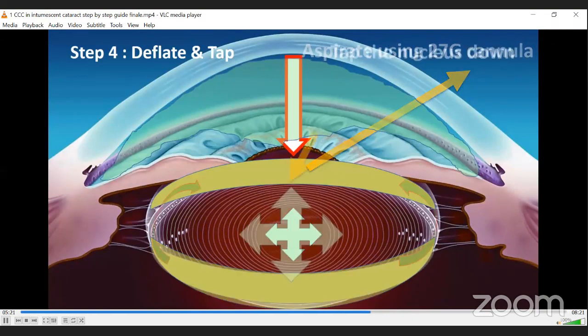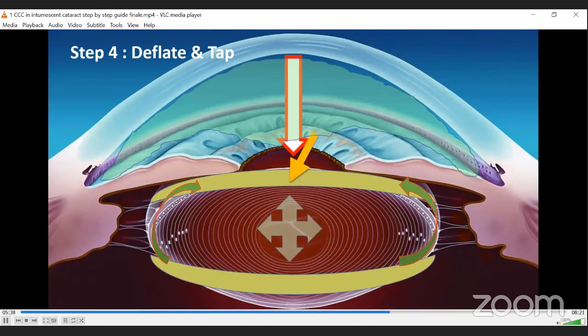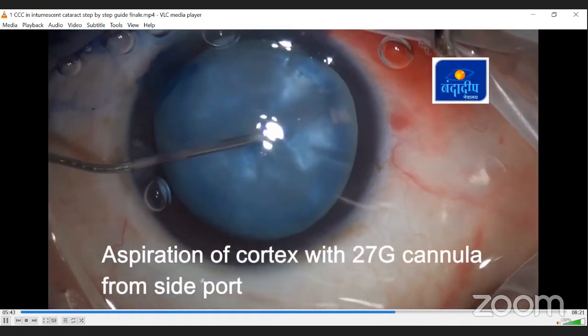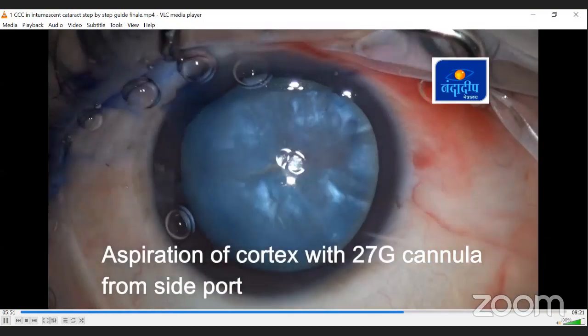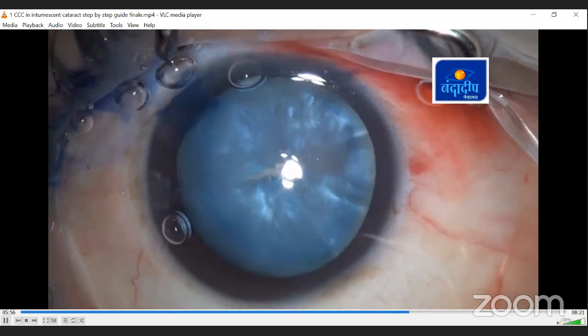So now we come to the fourth step, which is decompression of the lens. So how to do that? We use a 27 gauge cannula again from the side port. So again, I am going to maintain the anterior chamber. I am going to aspirate the fluid. I am going to tap the nucleus down as I have shown here, so that the fluid which is behind the nucleus also comes up around the equator. And you can actually see that the anterior capsule is getting more and more flattened.